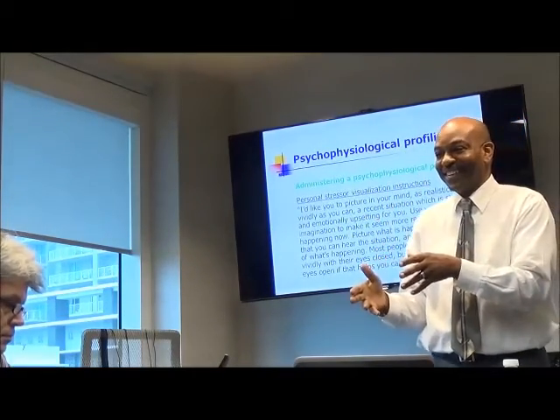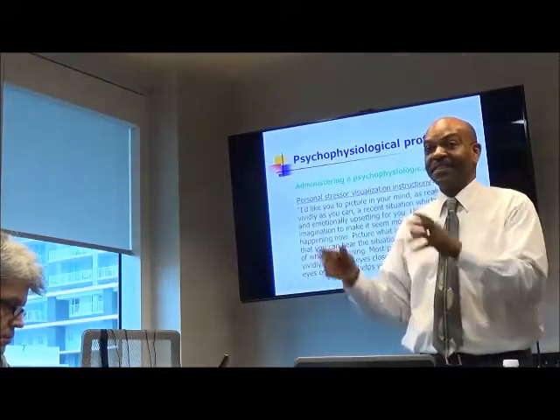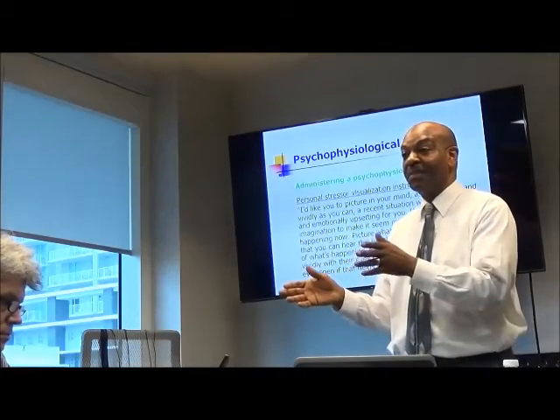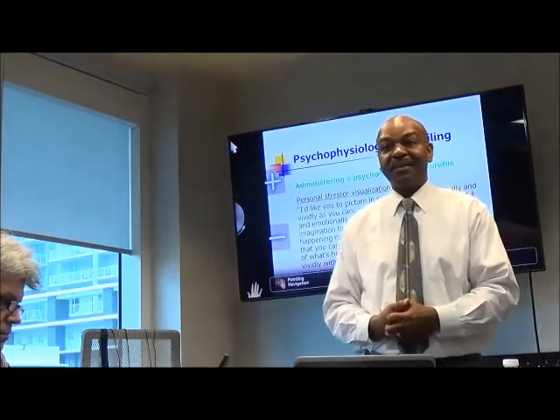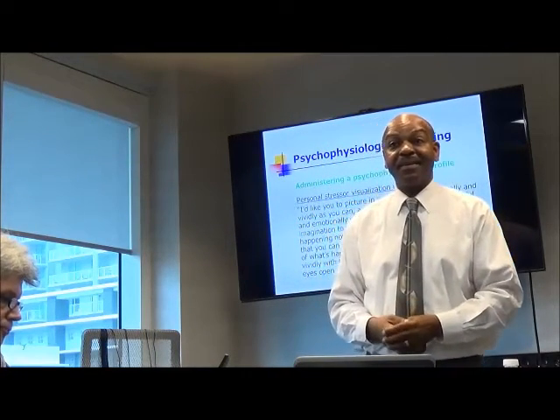from their normal condition. Exactly. It's a condition that shouldn't be, it's not really normal, but it's normal for them. And so now they're distracted from their normal condition. It's an attention problem. Yeah. They are moving their attention to another theme, another subject. Yes. And you can prove that with brain mapping also.